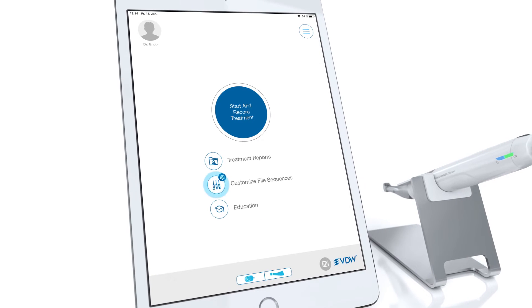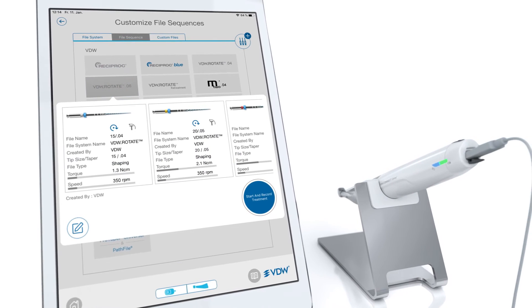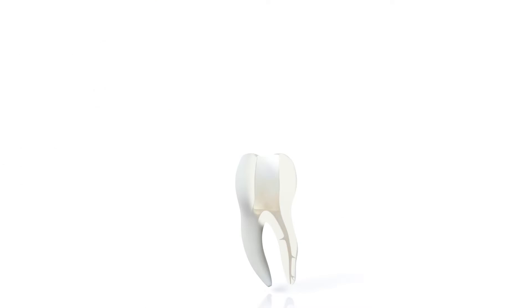Be sure to choose the appropriate torque-controlled electric motor setting according to the VDW rotate instrument size. These settings are already pre-programmed in your VDW connect drive motor.